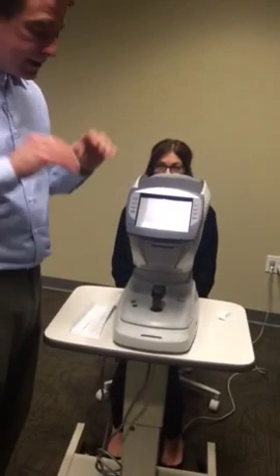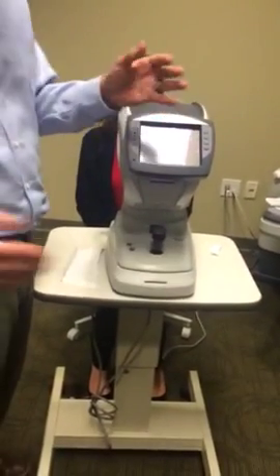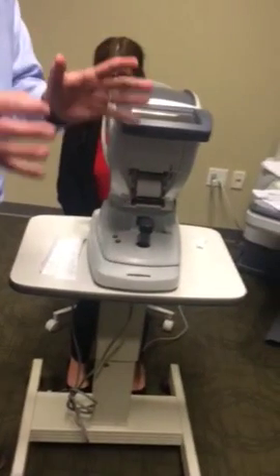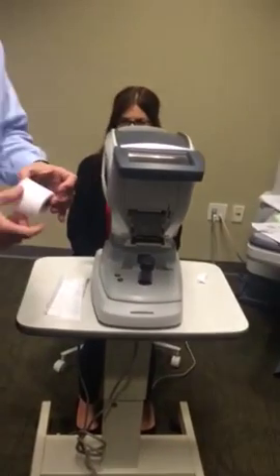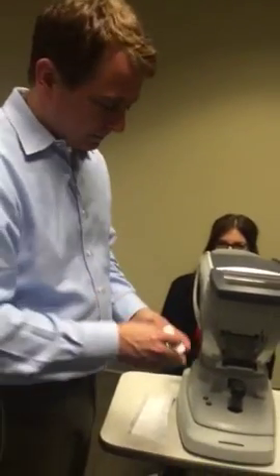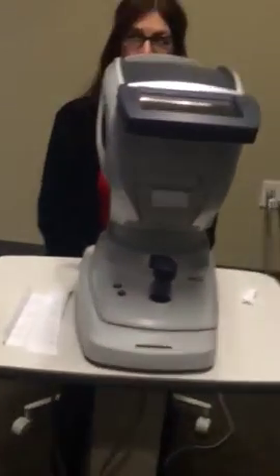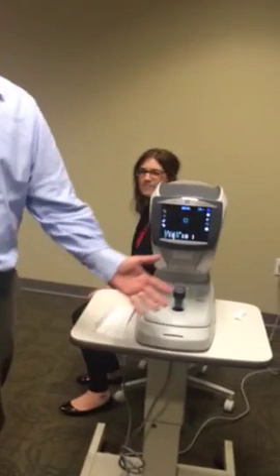Lastly, the greatest technological advancement of all time in autorefractors — it's like you guys talked, we listened: changing printer paper. No little levers, no need for a magnifying glass, no need for an engineering degree. It's just like hanging toilet paper. Round of applause, please. That's it.